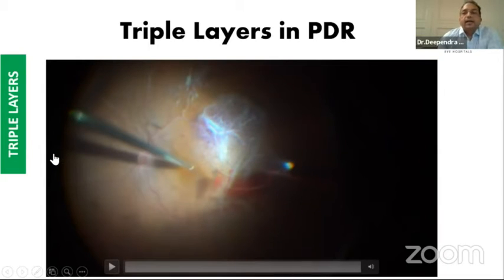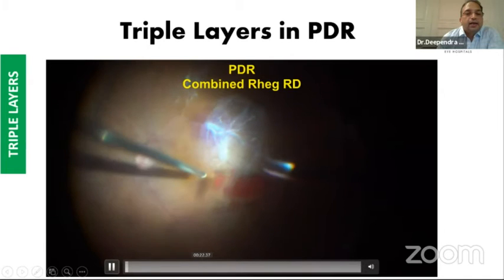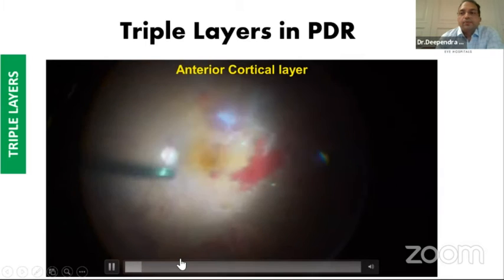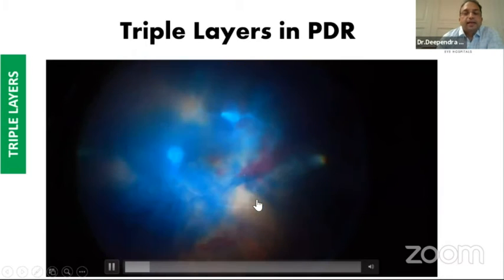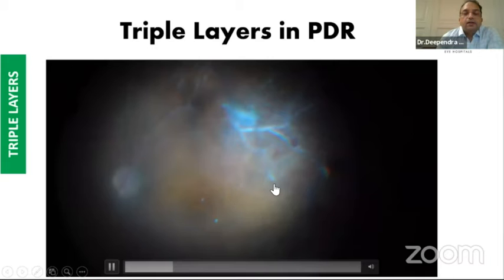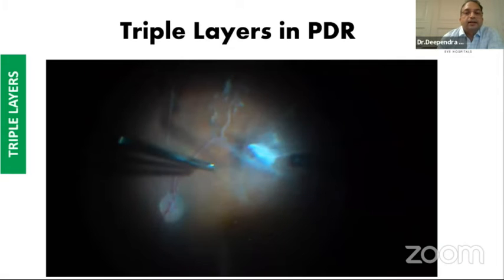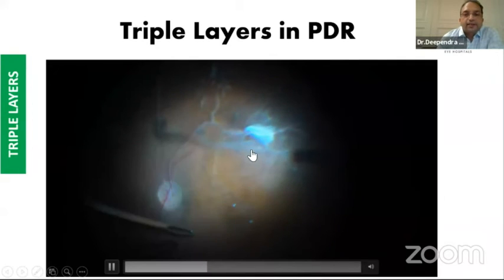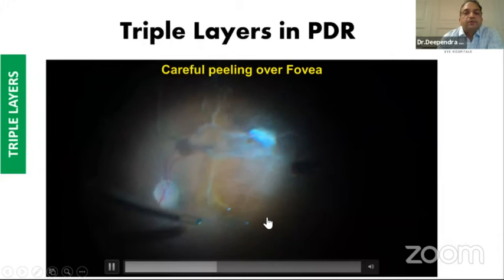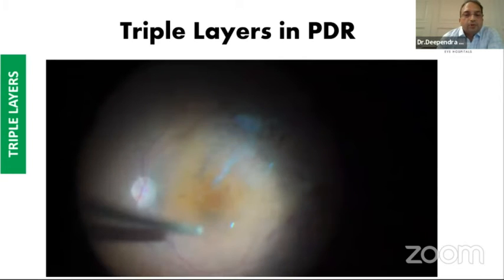Now the second topic — there are two conditions where we deal with traction and there are actually three layers which we have to remove. One is proliferative diabetic retinopathy. Dr. Sorab is a big fan of staining and re-staining to find all three layers. Here I have removed the anterior vitreous, then stained and could partially highlight the posterior layer of the vitreous cavity, and I'm peeling it. You can see there is a pre-existing break at the base of the neovascular complex — in these ischemic retinas you have to peel more carefully, don't be in a hurry, and you have to modify your peeling direction to avoid tears.